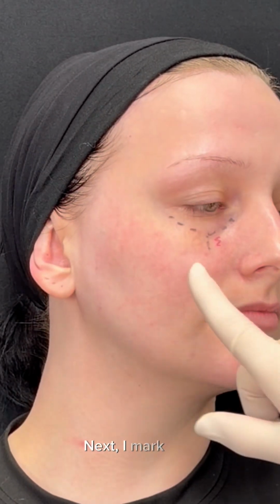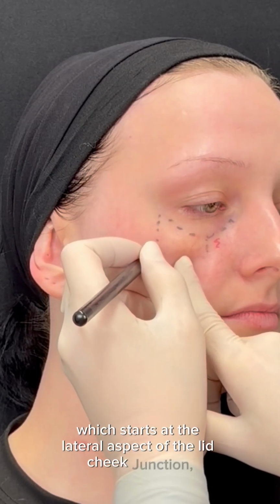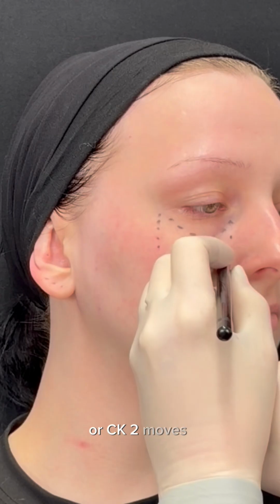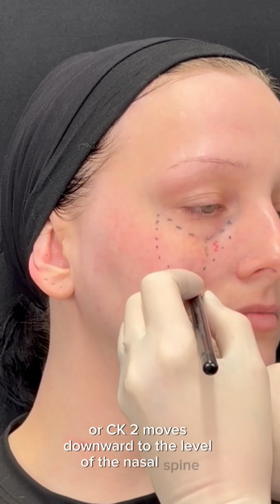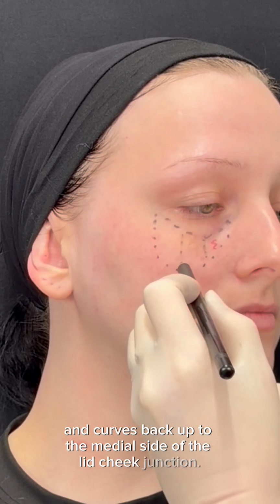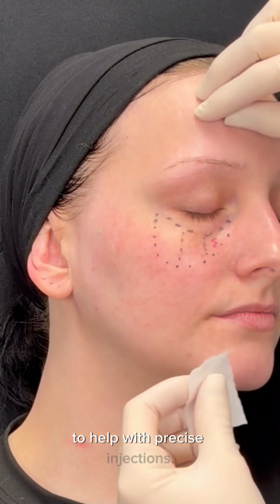Next, I mark CK3, which starts at the lateral aspect of the lid-cheek junction, traverses the zygomatic eminence or CK2, moves downward to the level of the nasal spine, and curves back up to the medial side of the lid-cheek junction. I divide CK3 into 3 compartments to help with precise injections.